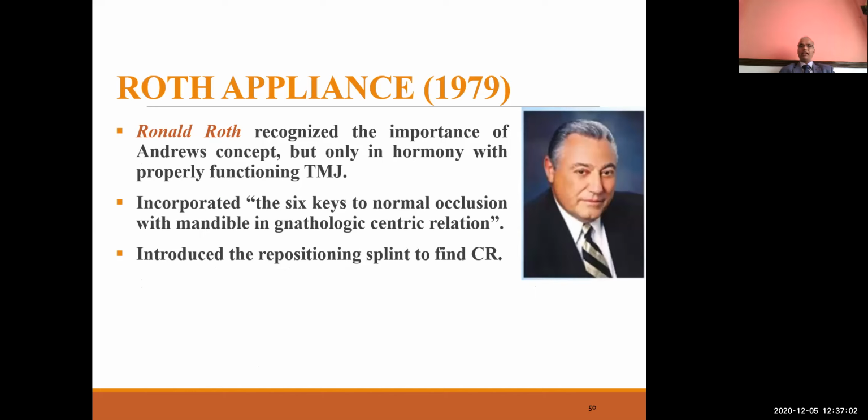Ronald Roth recognized the importance of the Andrews concept, but only in harmony with a properly functioning temporomandibular joint. He incorporated the 6 keys to normal occlusion with the mandible in gnathologic centric relation. He introduced the repositioning splint to find the centric relation.